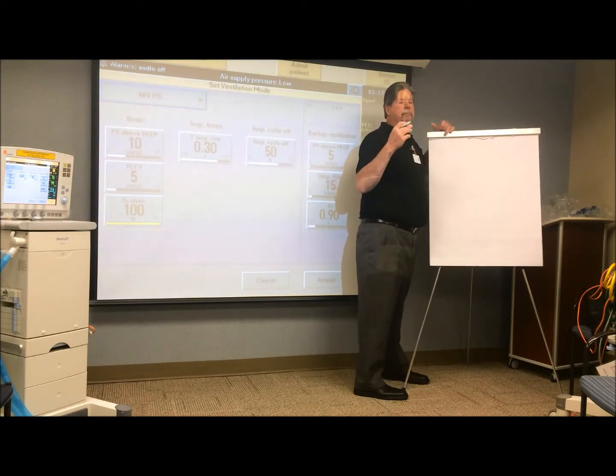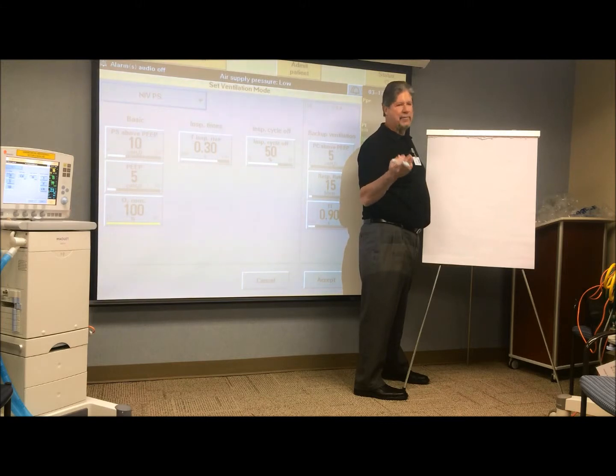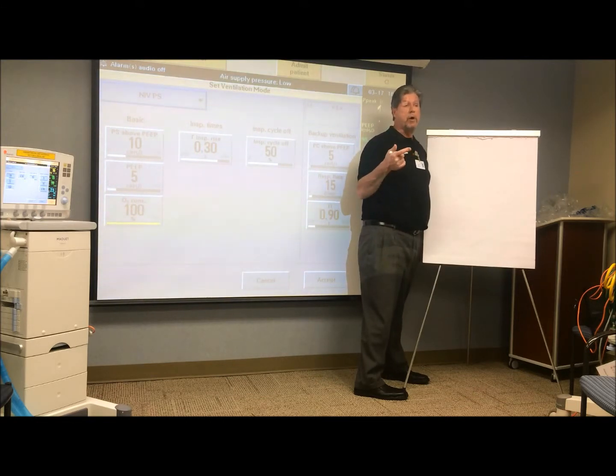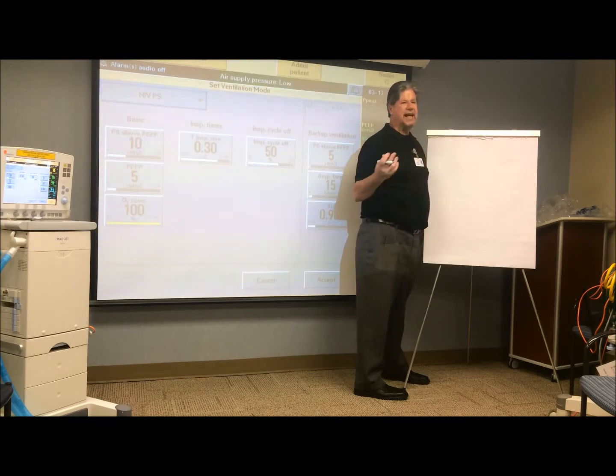Whenever you're in a mandatory mode, like pressure control or volume control, you always have an I time that tells the ventilator when to start the breath and when to end the breath. Let's say you set a one-second I time. But in a support mode, like pressure support, the ventilator has no time. There is no time associated with the delivery of that pressure support breath. So consequently, the ventilator still has to have a way to terminate its breath when you're in that spontaneous breath.